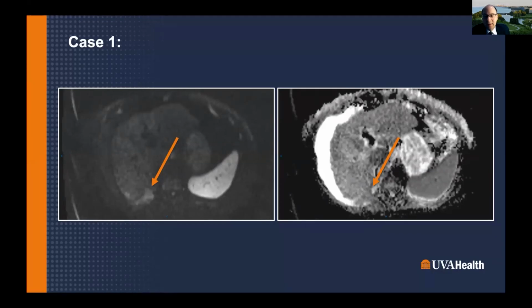Although I think as an imager, it'd be a lot easier to specifically look at 3 months as opposed to early 4 weeks or 6 weeks, as you described.